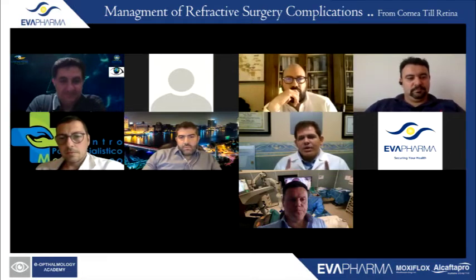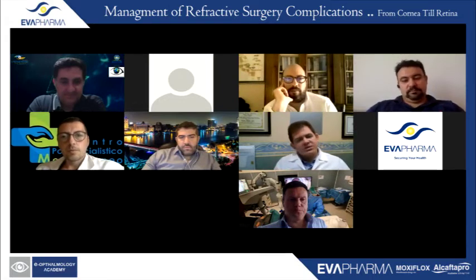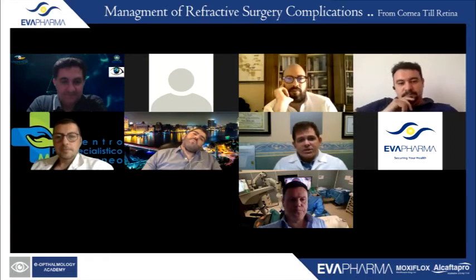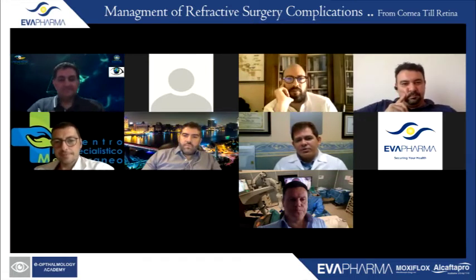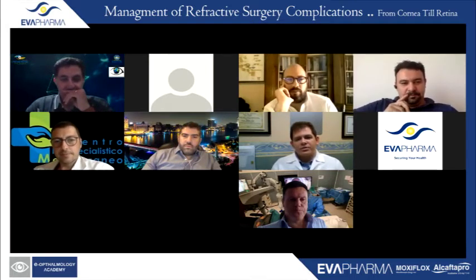But if you consider 2 wavelengths, it will give you a lot of information about the corneal structure, about corneal optics. Maybe even the index of refraction could be measured. So I would say that the best machine would integrate. It's multimodal, beyond but not over. Coming to the idea, I have a Scheimpflug, throw out your Placido disc, not true. I just saw the talk from Eric with beautiful slides on dry eye, and this is pretty much Placido disc. Yeah, you need to go beyond but not over. But I believe the future relies more and more on OCT technology.